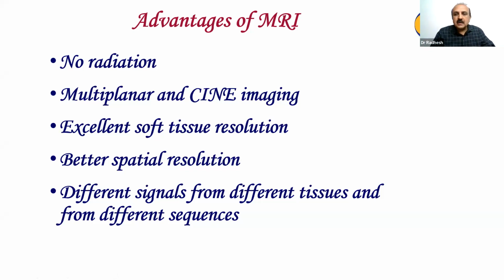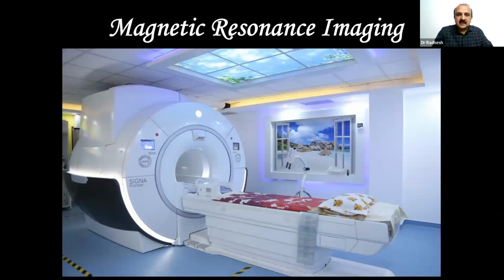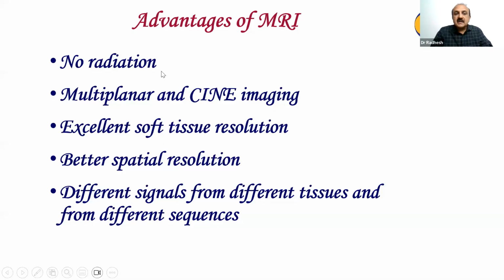Please remember, your mobile works on radio frequency. In fact, if you take this mobile into the MR room and close all the doors, your mobile does not work because there is a cage surrounding the magnet. This entire thing is a radio frequency cage, which does not allow external RF to come in. So your MR has radio frequency. That is why we do not bombard these patients continuously with radio frequency.